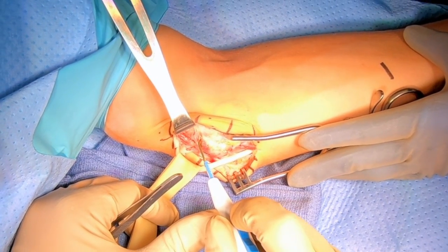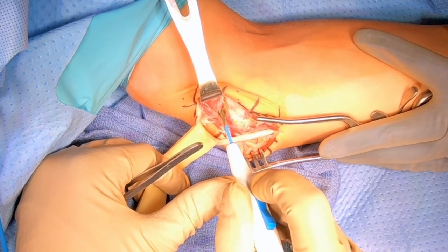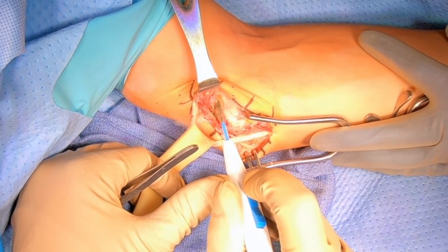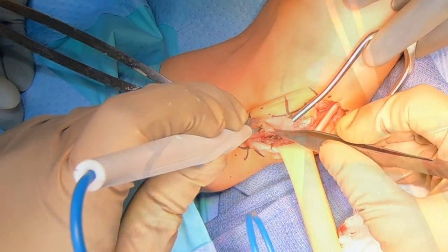We'll remove some tissue right here behind the epicondyle called the septum. Removing this tissue is critical to make sure that when the nerve is moved out of harm's way it's not tented over this tissue and not stretched. Stretching the nerve is very bad for it, so you can see me here removing the septum to make sure that the nerve is not under any tension during the procedure.